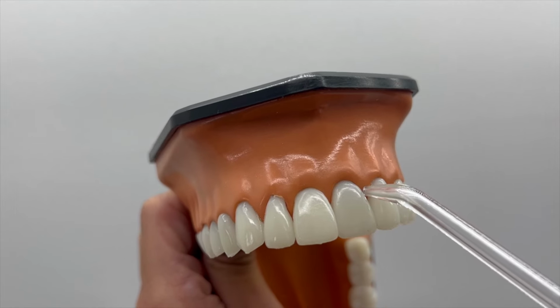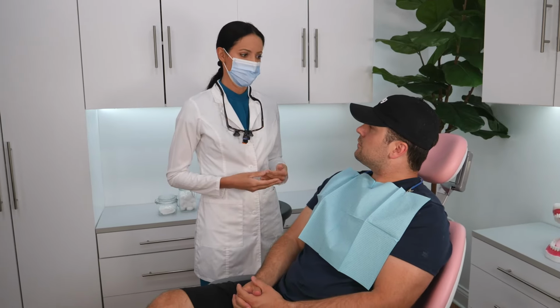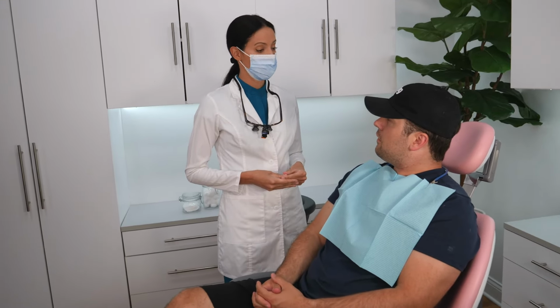Also, you don't really want to press the tip of the water flosser right against the gap of your teeth. I recommend to my patients that they just aim it at the gap. Again, always check with your individual dental provider and how they prefer you to use it in your individual mouth. This is just a generalized video, but overall, I love a water flosser. It helps keep our gums healthy by stimulating them with high pressurized water. Again, check out that other video of mine to learn about who benefits the most from using water flossers.